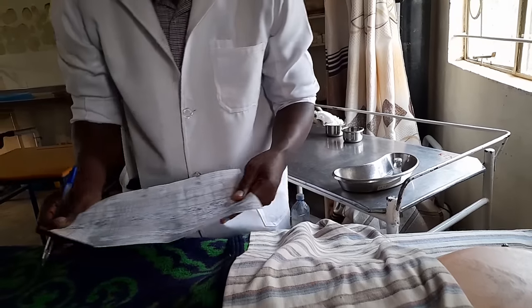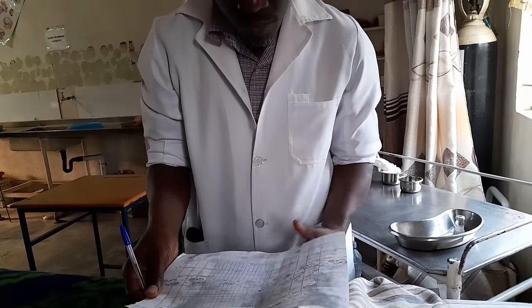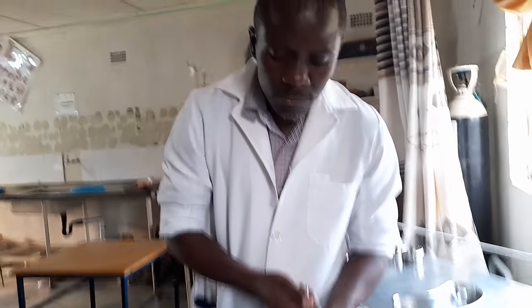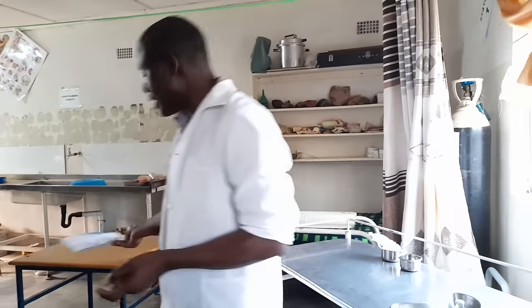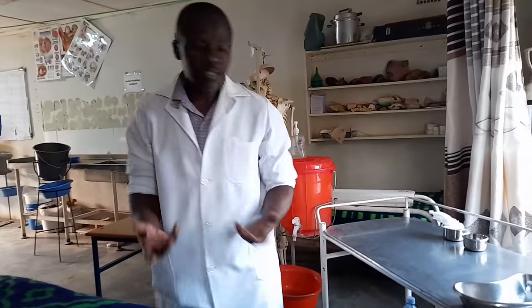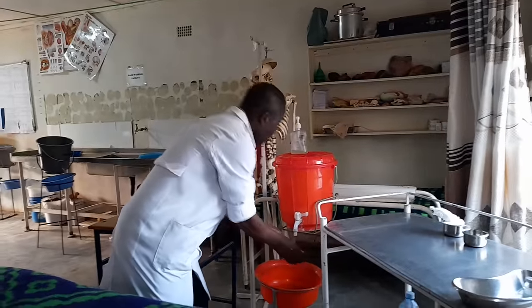Report to the nurse in charge: 'I have given Ampicillin 500 milligrams to Mr. Luwoya, and I have left the patient comfortable.' This is the injection giving procedure. The last step is to do the final hand washing.